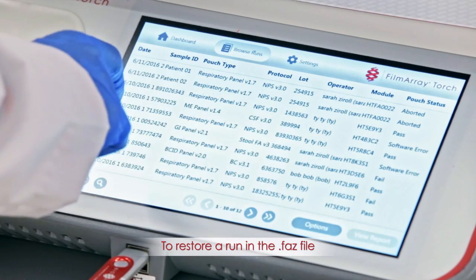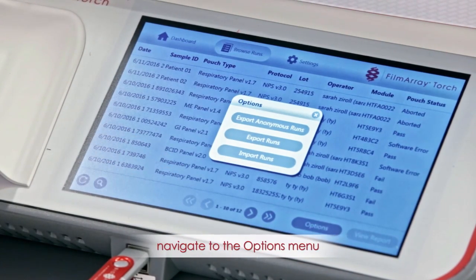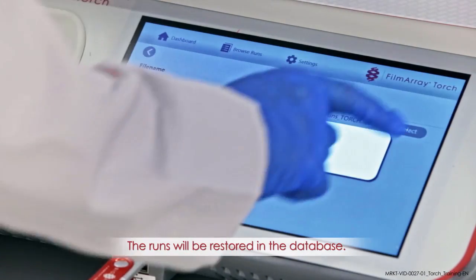Restore Runs. To restore a run in the .faz file after it has been removed, navigate to the Options menu and select Import Runs. The runs will be restored in the database.